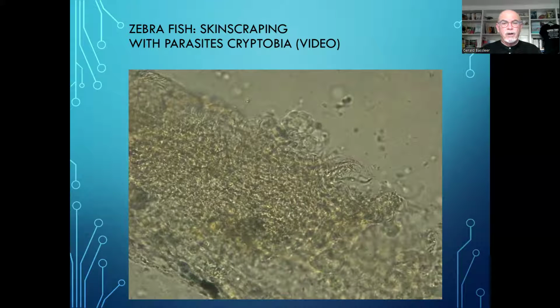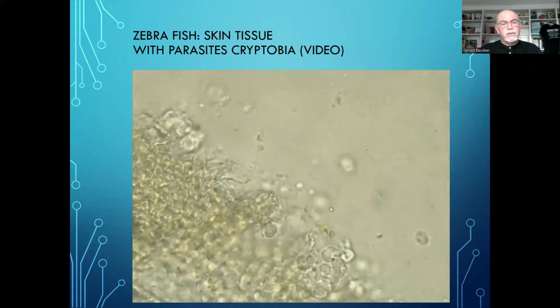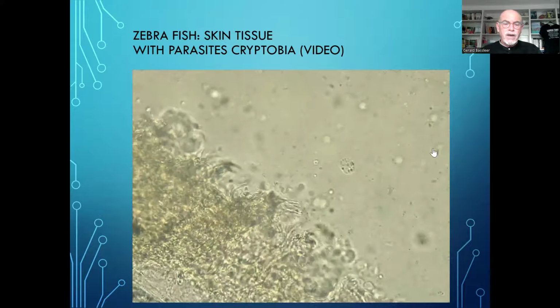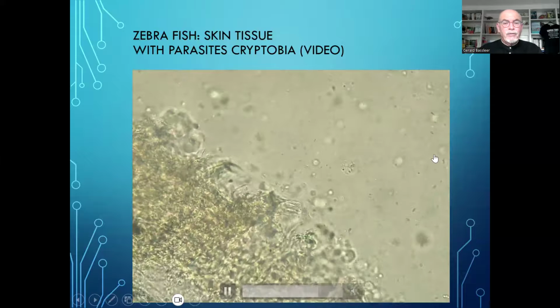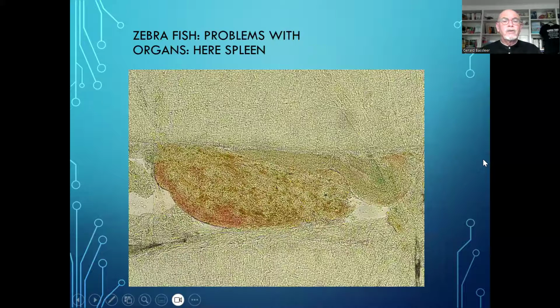I would think 400, but it's hard to diagnose exactly without a microscope. Here we see a more detailed observation at 400, and you see all the tiny little bugs causing damage. Yes, on the fish, on the gills also, but this is on the fish.